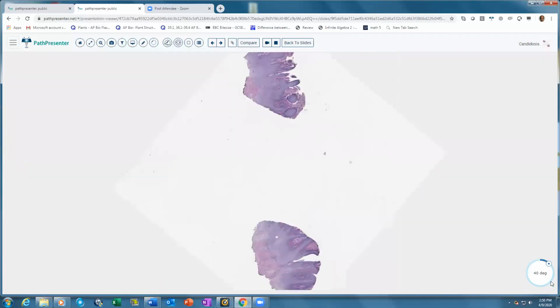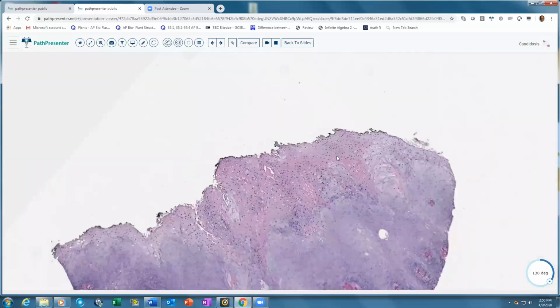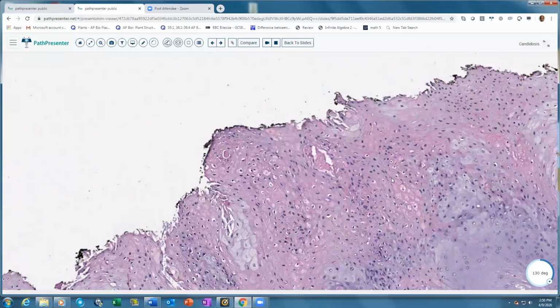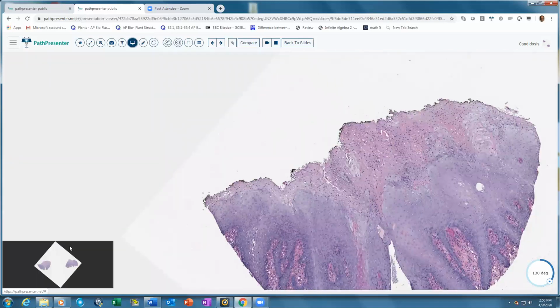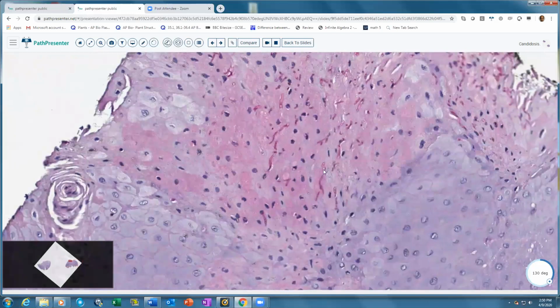When we talk about candida, it is usually the vertical orientation of the fungus that helps the histological diagnosis. So here we see the hyphae oriented vertically to the epidermis.